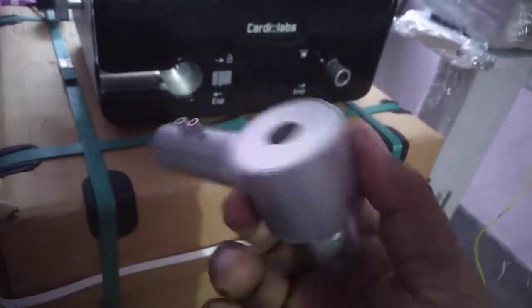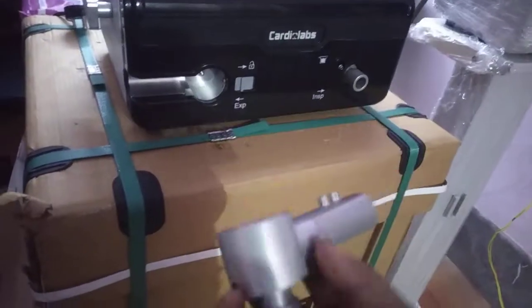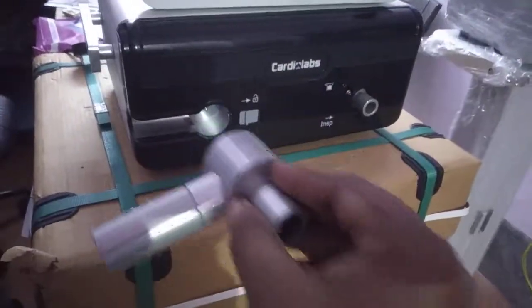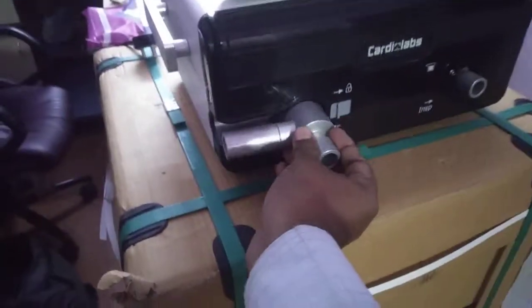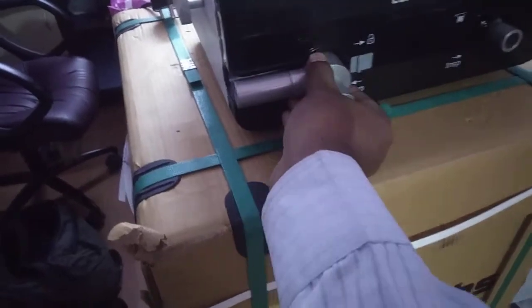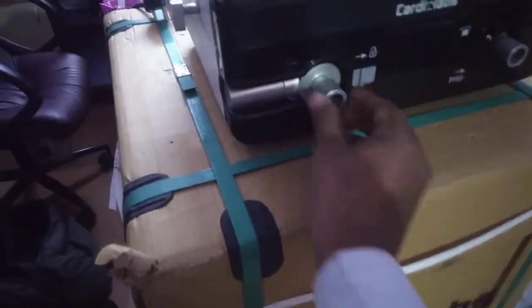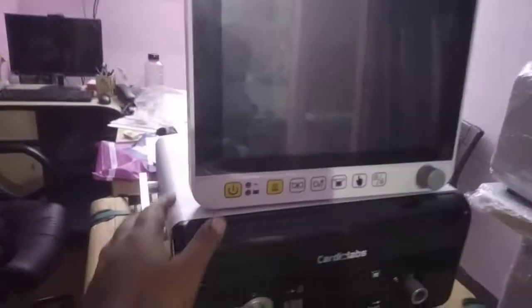Because it is autoclaveable, it is very easy to take out, autoclave, and then reset. To fix it back, just push it and it will automatically lock — you will hear a sound confirming it is locked. To start the ventilator, press this button for a few seconds and it will power on, bringing you to the standby screen.